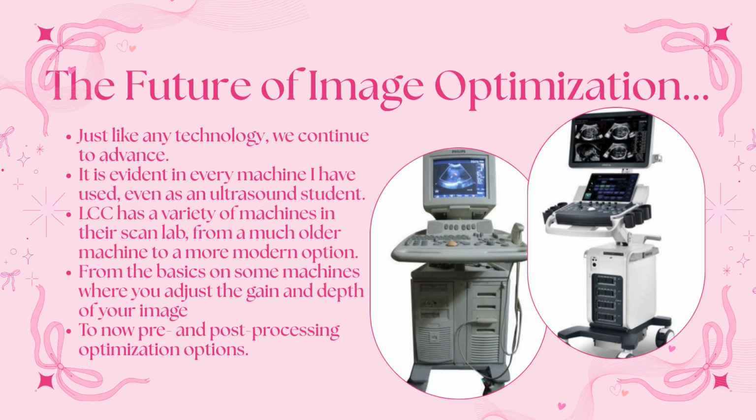Just like any other technology we continue to advance, it is evident in every machine I have used, even as an ultrasound student. Actually, LCC has a variety of machines in their scan lab, from much older machines, like the first image, to more modern options, like the second image. From the basics on some machines where you just adjust the gain and the depth, to now pre and post processing optimization options.